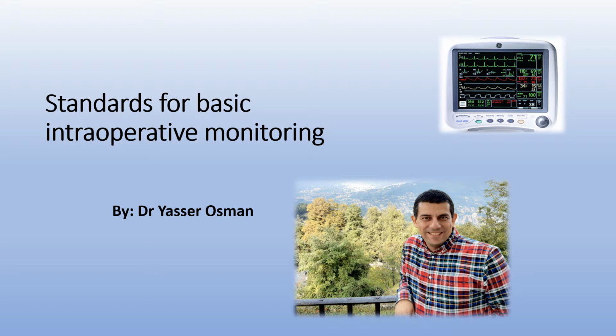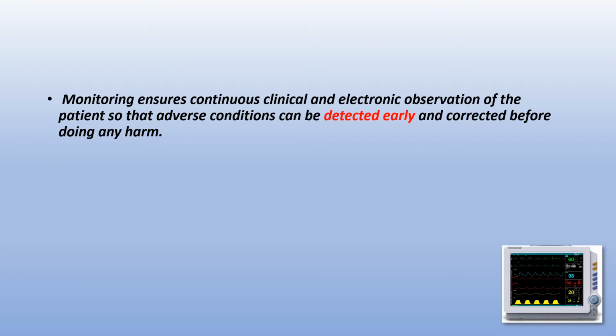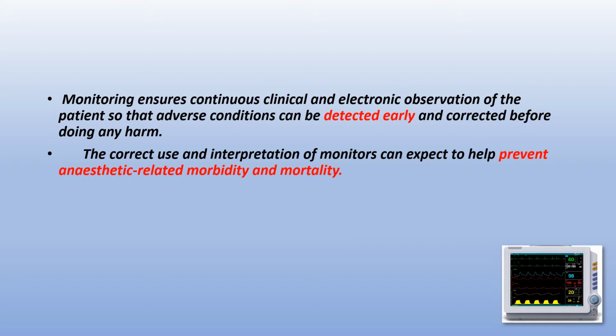And I wish to talk to you in this presentation about how to monitor the patient in the intraoperative period. Monitoring ensures continuous clinical and electronic observation of the patient so that adverse conditions can be detected early and corrected before doing any harm. The correct use and interpretation of monitors can be expected to help prevent anesthetic-related morbidities and mortalities.